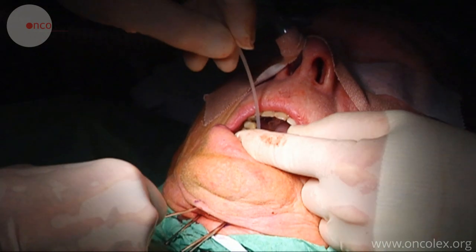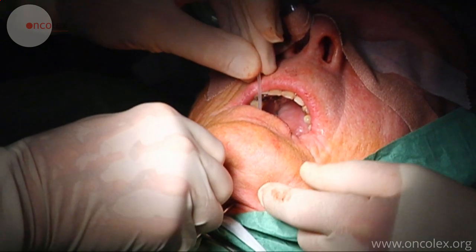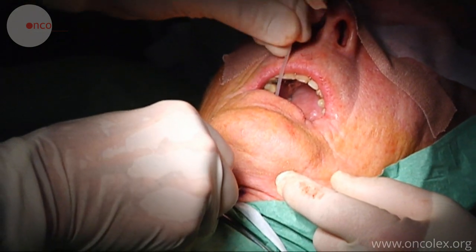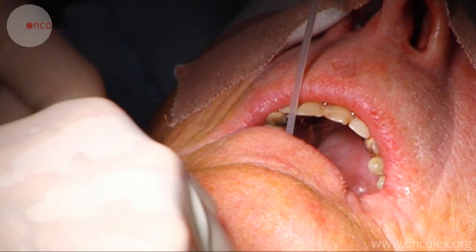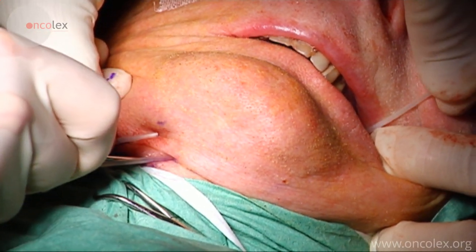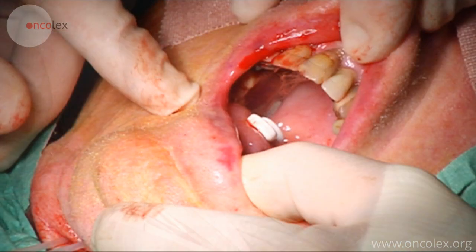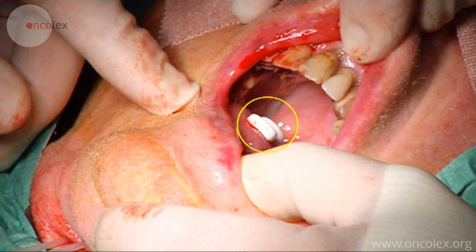The plastic catheters are threaded down into the needles, and the needles and catheters are pulled down through the tongue. The ends of the catheters function as stoppers on the upper side of the tongue.